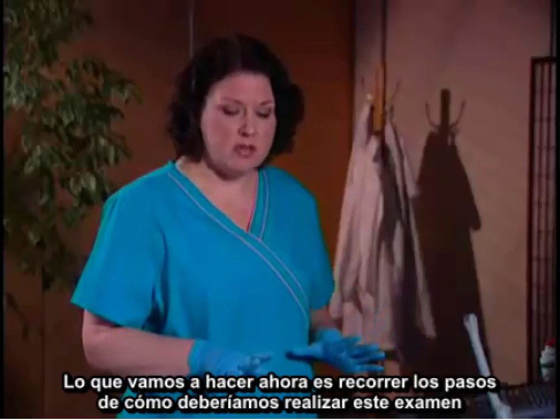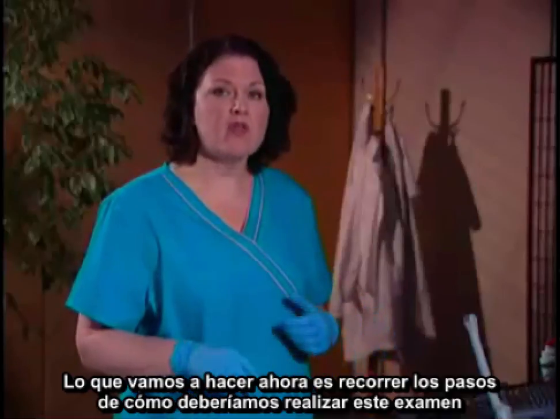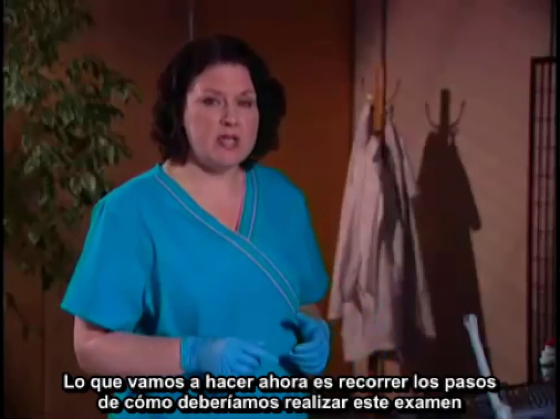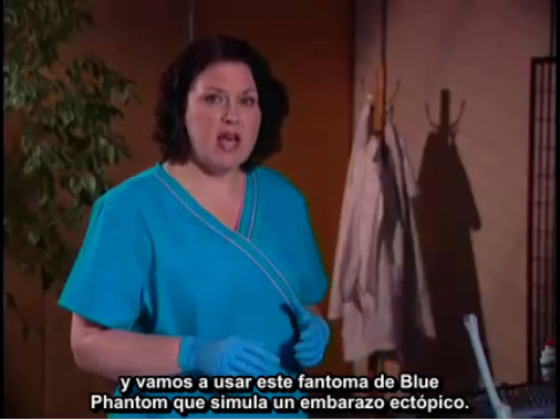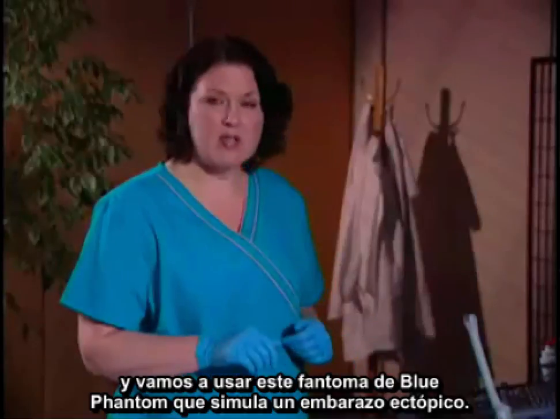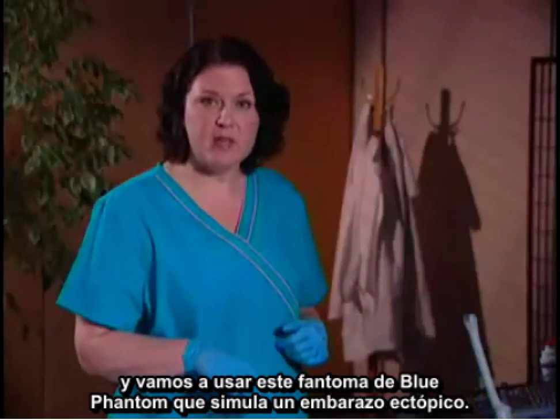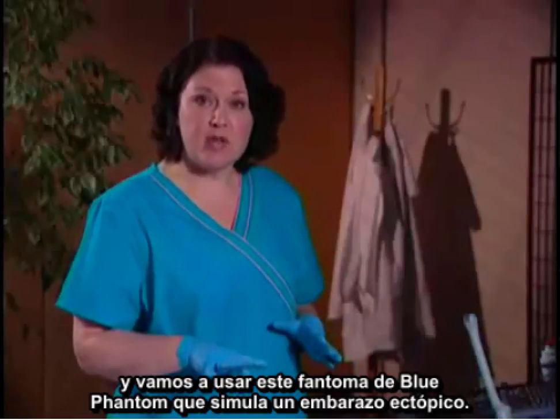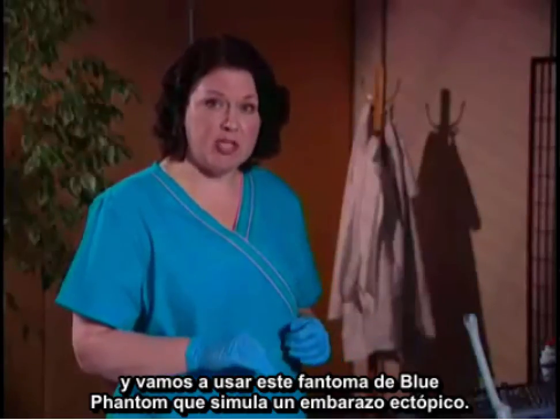So what I'm going to do right now is walk through the steps on how you would do that examination, and we're going to use this phantom by Blue Phantom that will actually demonstrate an ectopic pregnancy.